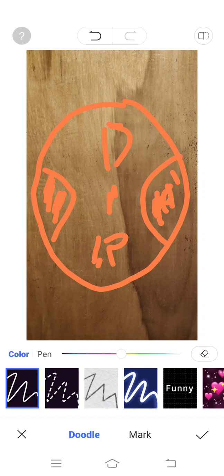But if you move your head, that means the line of sight would fall, if you're looking at far, it will fall in this area. Okay, the distance area. If you're looking at the intermediate distance, you're using this area here. Okay, the middle. Then if you're reading, you're using this area here. Okay, for reading at 16 inches. So that is the dynamics of a progressive lens.